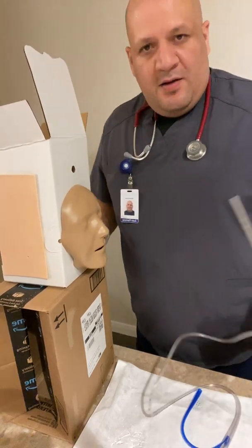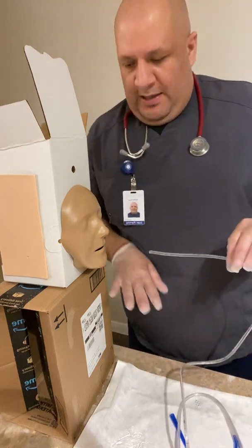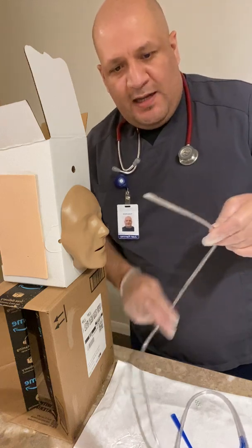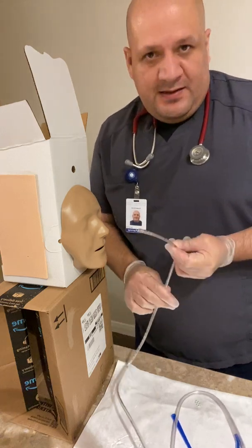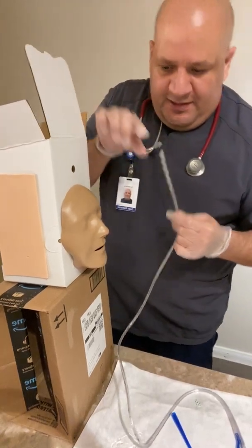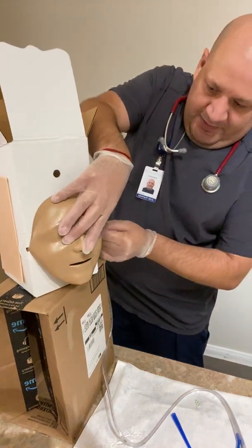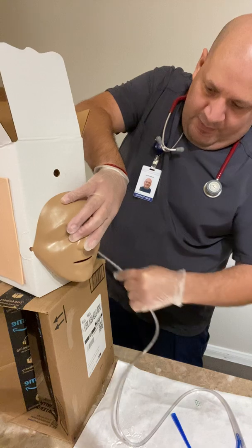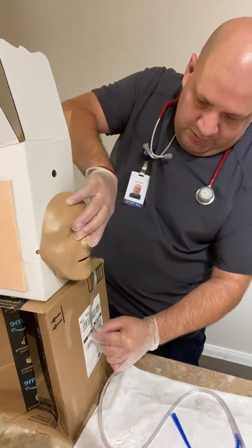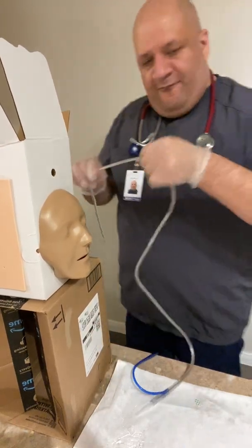Okay. I'm going to go ahead and measure my tubing. And before I started examining the patient, I would place my tubing in warm water so it can loosen up and be more flexible. So when I do put it in, I'm going to measure from the tip of the nose, okay, to the tip of the ear. And then we're going to go to the tip of the xiphoid process, okay. And we're looking at 40.